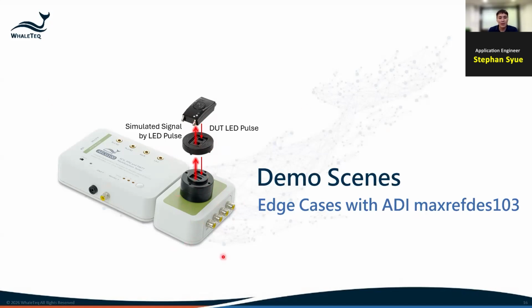If there's a more complex LED PD layout, we can talk about it after this or offline, and reach out to your sales representative. Two years ago we had a webinar about how to properly accommodate complex LED PD layouts, spread like in a circle or spread like in a square, and we also have a solution just for that.